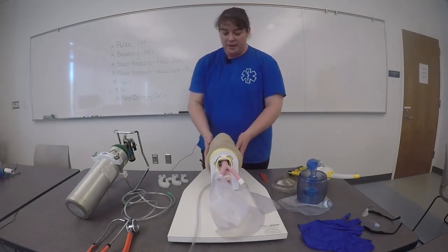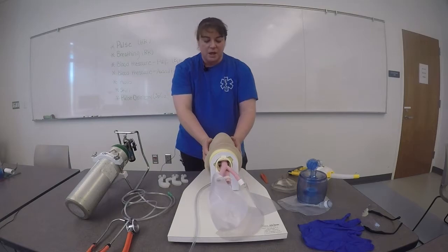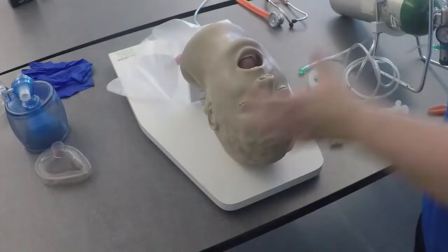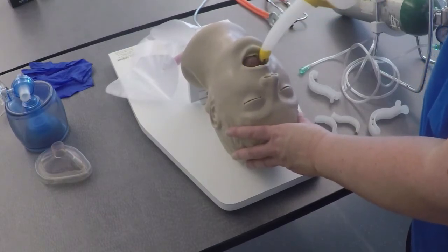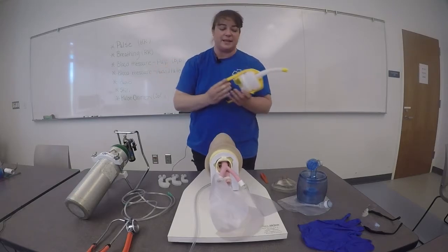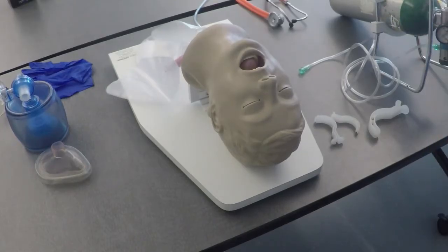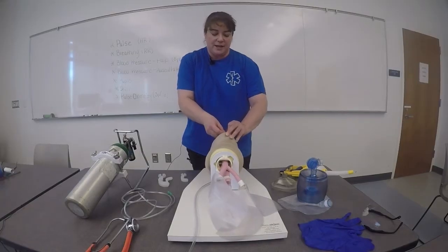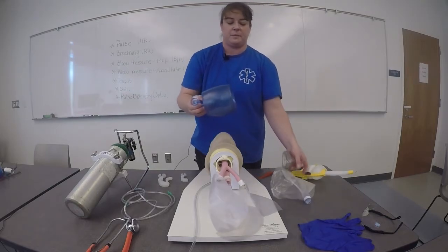I'll open the airway with a head tilt, jaw thrust and look in the mouth. The mouth is full of secretions and vomit, so I would roll the patient to the side and clear any large chunks and then prepare for suctioning. I'll use my manual suction and I'll be measuring from the tip of the earlobe to the corner of the mouth. I'll go no further than that or as far as I can see. Suction on the way out in a sweeping motion for no more than 15 seconds. I would then use my tongue blade to push the tongue posterior as I go in with my oropharyngeal airway, or OPA, and I will rotate 90 degrees until the flange rests against the teeth. No gag reflex present. Patient accepts the airway adjunct.